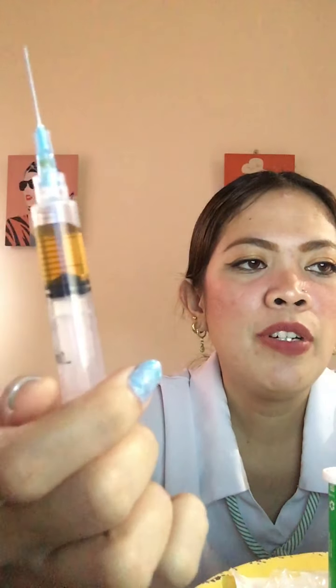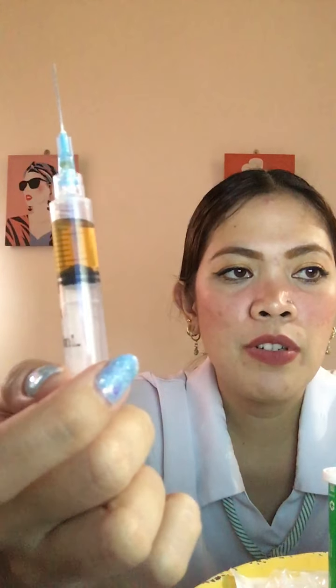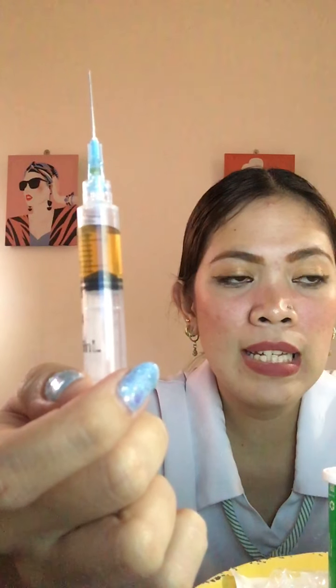Then after, you have to dispose of the filter needle by placing it in a sharps container. You have to do the correct disposal of the needle and the glass to prevent accidents, contamination, and transmission of infection. So it's to control the transmission of infection. That's why you have to dispose of it in the correct bin.